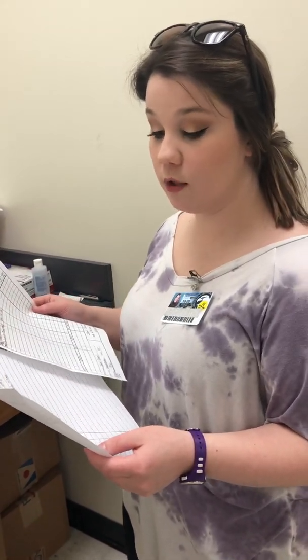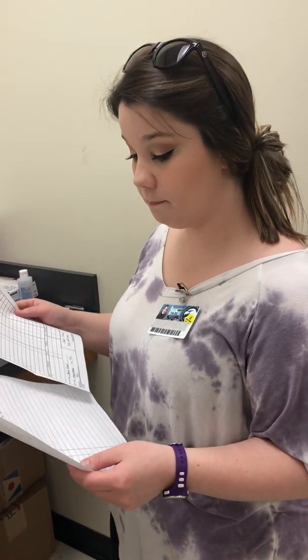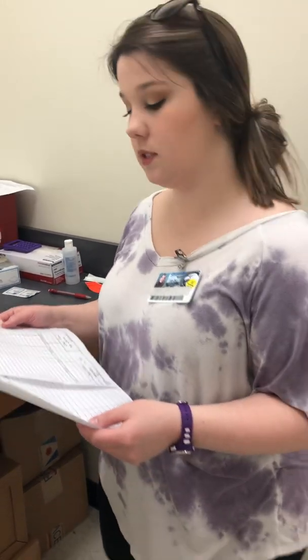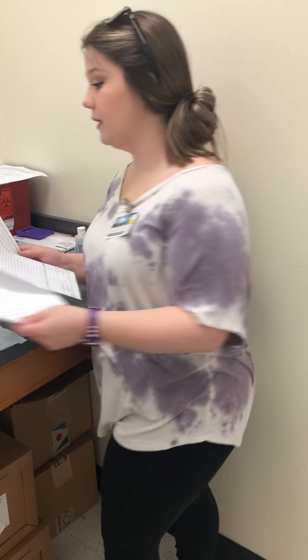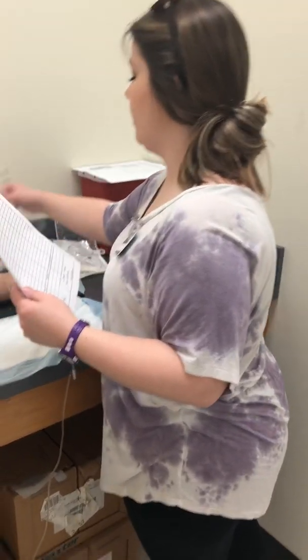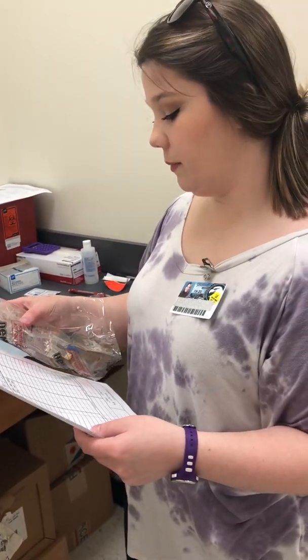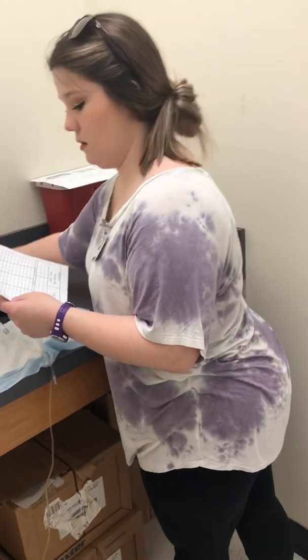I'm looking up allergies, and she says here that she's allergic to penicillin. Okay, and she also has the D5W hanging in the room. So, all right. Now that I've checked that, I'm going to compare my medication to my MAR. All right, comparing it, and then I'm also going to look for clarity and the expiration date, which is in date. So, okay.